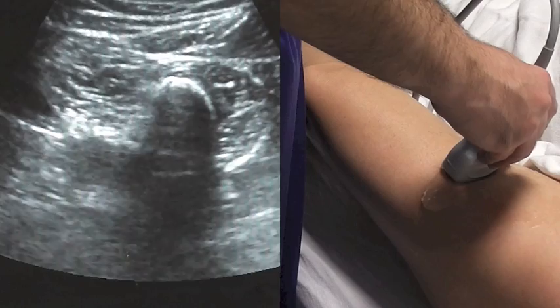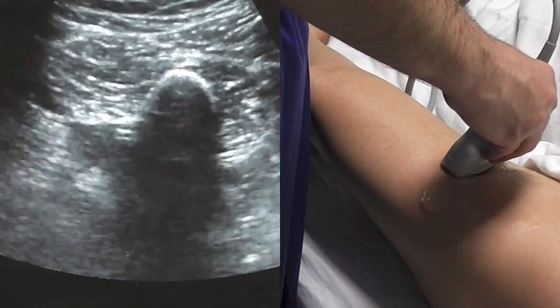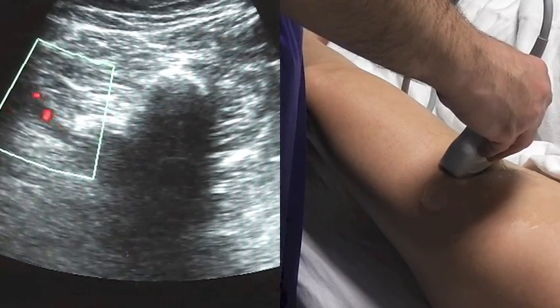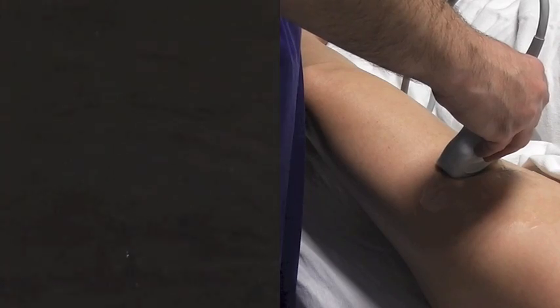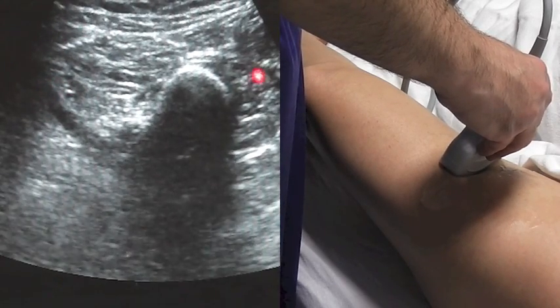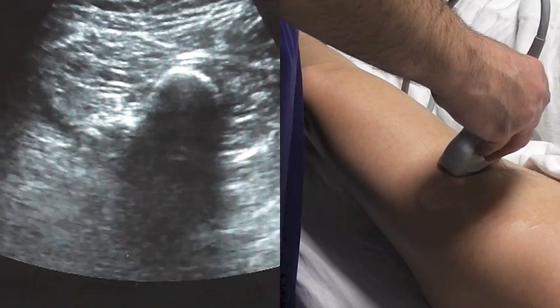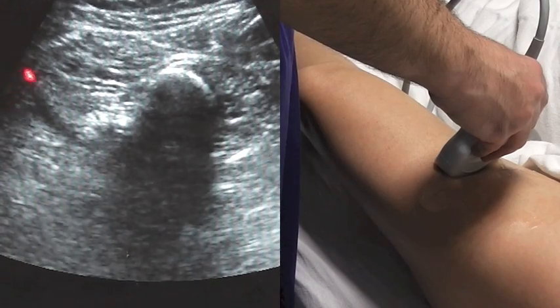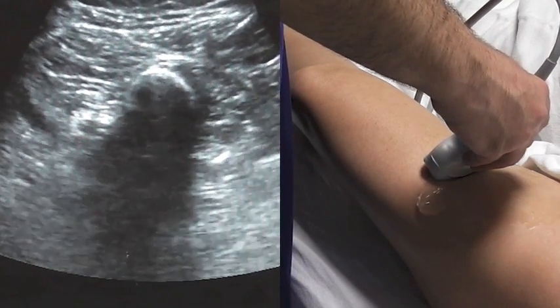Medially, what we're looking for and interested in are the femoral vessels. Sometimes, if we add our colored Doppler flow, it can help us identify these structures. Having identified the femoral vessels and the femur, we know that the sciatic nerve sits basically at the third point of a triangle with the femur and the femoral vessels, and we're looking for it right in this region to complete our triangle.